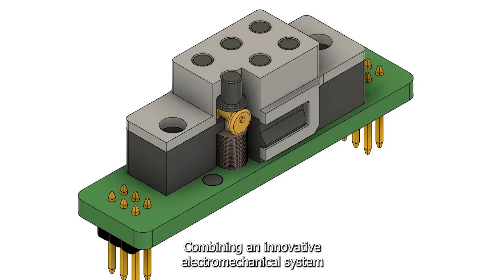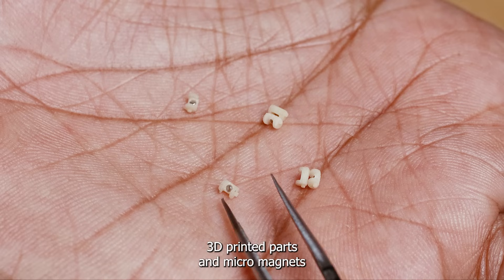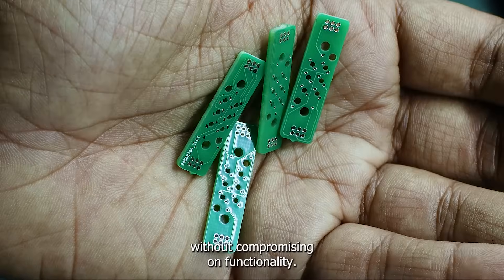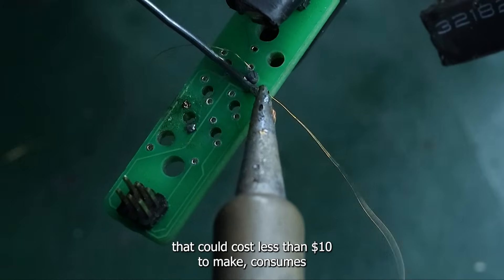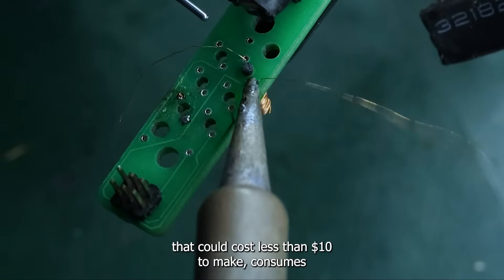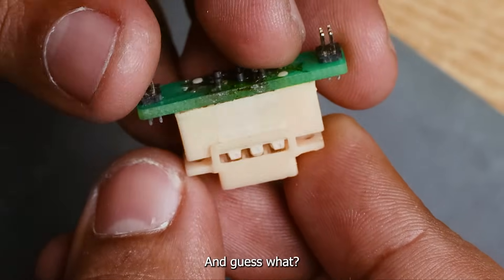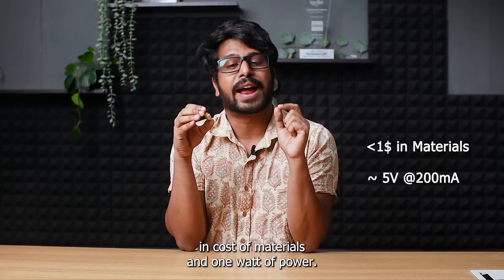Combining an innovative electromechanical system with off-the-shelf components, 3D printed parts and micro magnets — all working together to keep the costs low without compromising on functionality. Our goal was to build a braille cell that could cost less than $10 to make, consumes minimal power, and is easy to manufacture and assemble. And guess what — we made it happen at less than $1 in cost of materials and 1 watt of power.